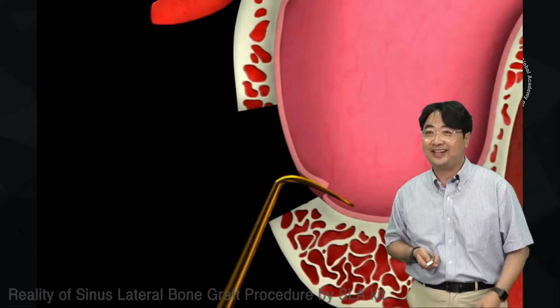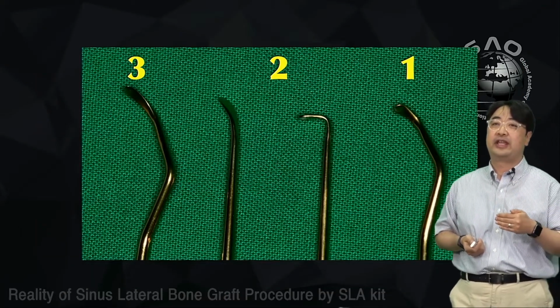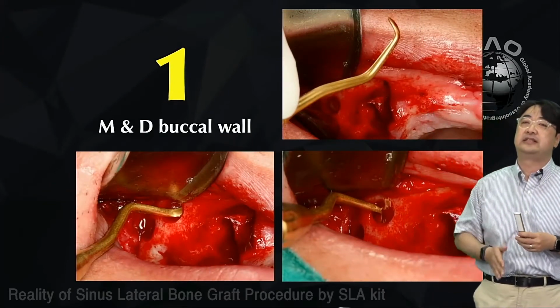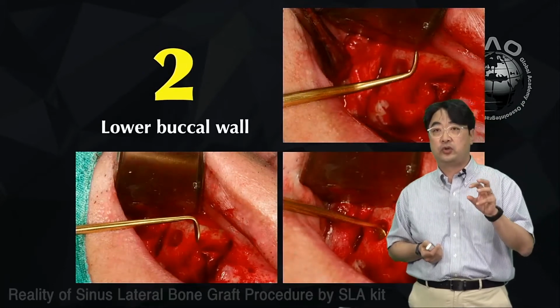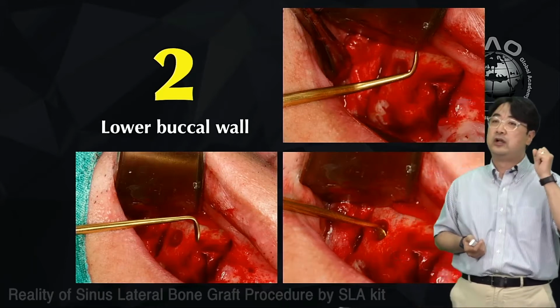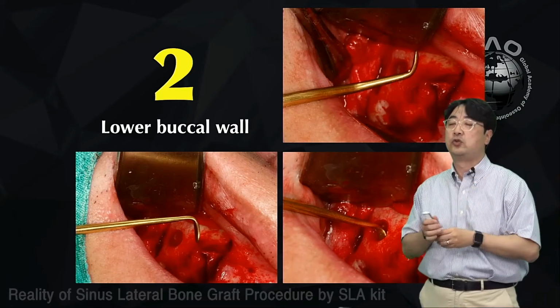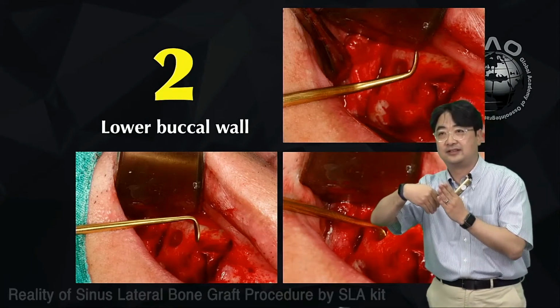In the SLA kit, there are 3 Freer elevators: number 1, number 2 and number 3. The number 1 is laser marked. With number 1, you dissect the medial and distal buccal wall, like this. And number 2 has 2 parts, a rectangular part and a wider part. The first time, you use the rectangular part of the number 2 Freer elevator. So it means you go down, right? You go down from the window that you opened, then go down to the crestal, right?